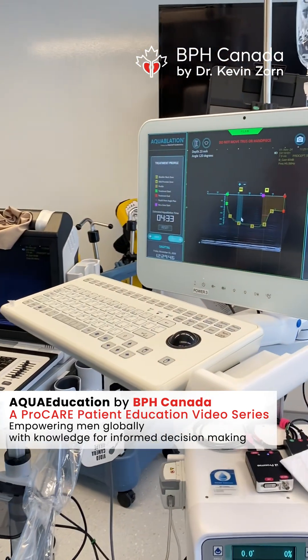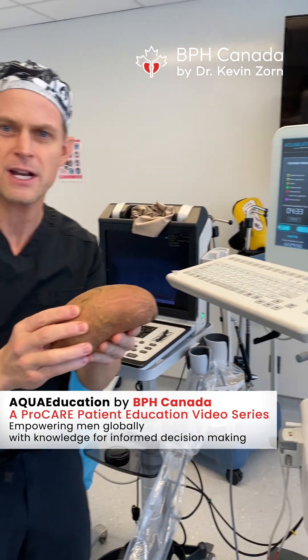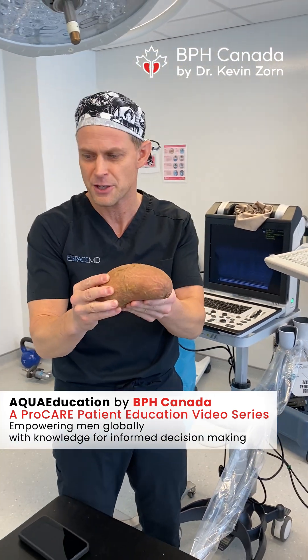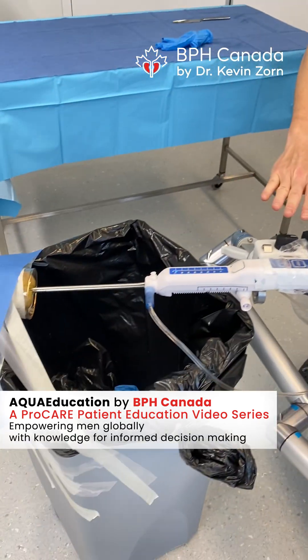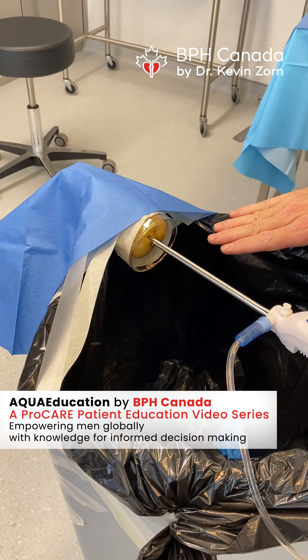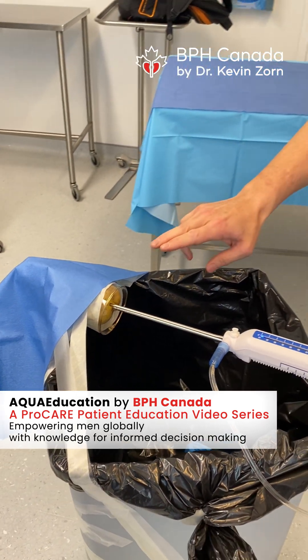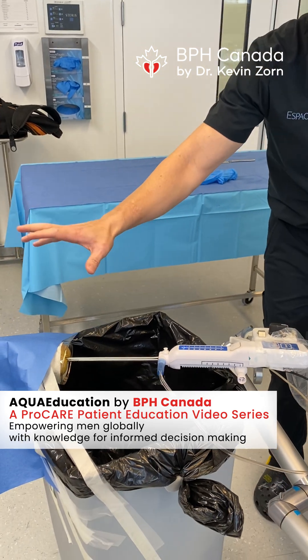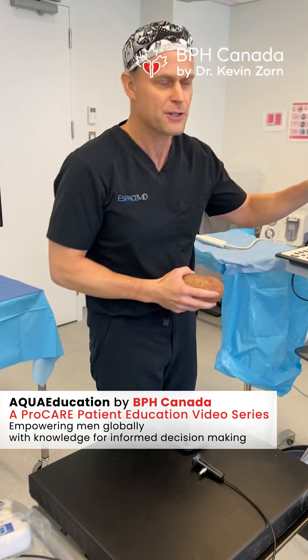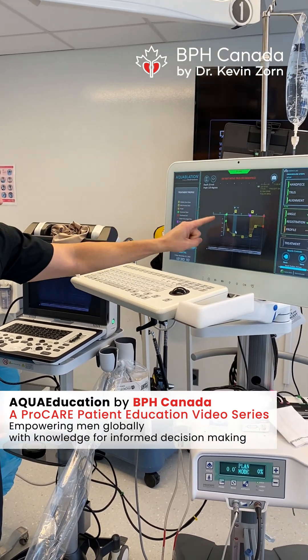This is how we map out. This is just a phantom area. We're going to be actually treating a potato. We've placed it here into the handpiece. This is what would be placed through the urethra, locked in by a secure arm into the prostate area, into the bladder, all under ultrasound guidance. So on this image, we see in real time what we're doing. We plan it exactly.